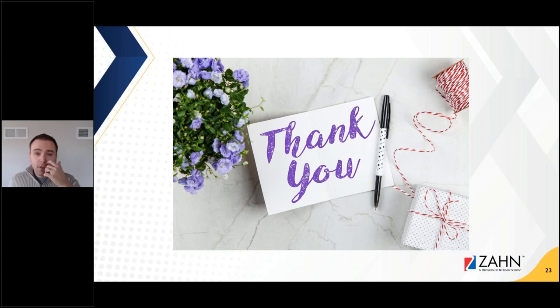It is part of the digital denture protocol to fabricate a try-in. That one is usually done in a fully white resin as a single piece. It gets 3D printed. In Lucitone's case, it's the exact same Lucitone resin, just with a different pigment, and everything's printed in just one piece, and you send it out. But I've really found that we, obviously, as a lab, always recommend it. We do not warranty our dentures if they do not get a try-in. But a lot of people don't care, so they do it anyway, probably because it's not that expensive to go ahead and remake it if they have to.